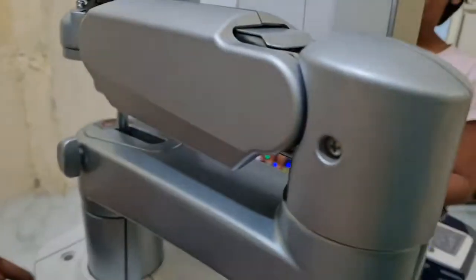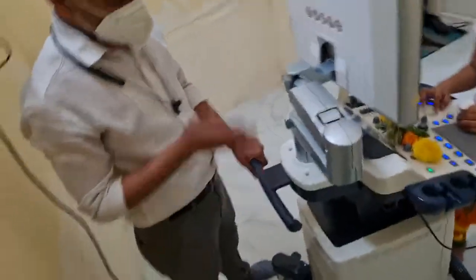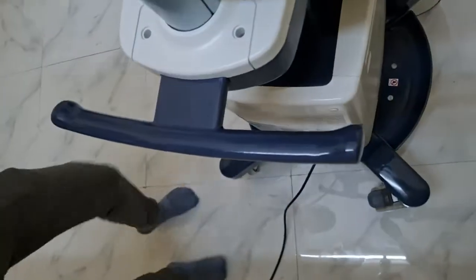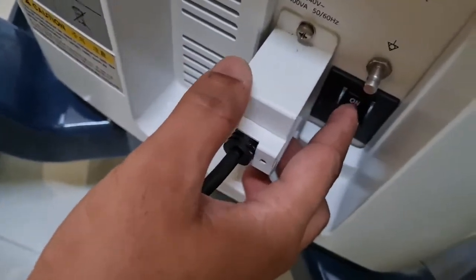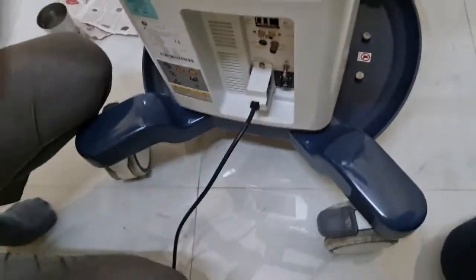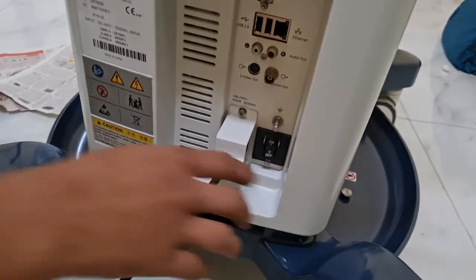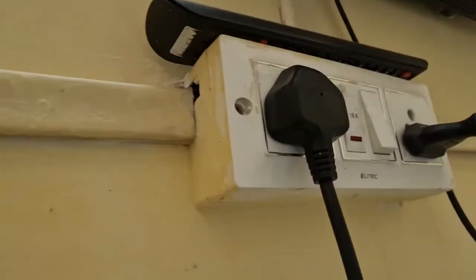Okay, this is the handle to move the machine from one room to another room, or from one place to another place. This is the machine wire, and this is the tripper button. If you want to move the machine from one room to another room, you can switch it off from here, and after that it will shut down.